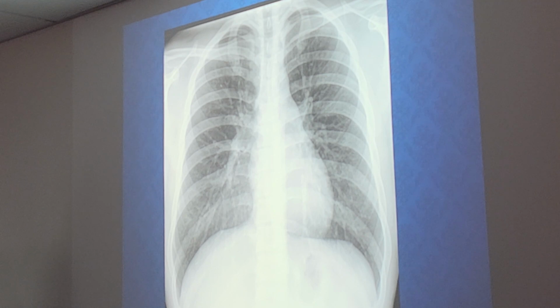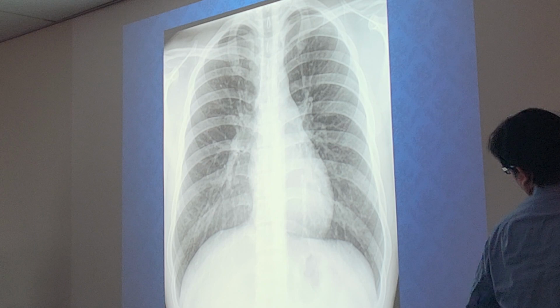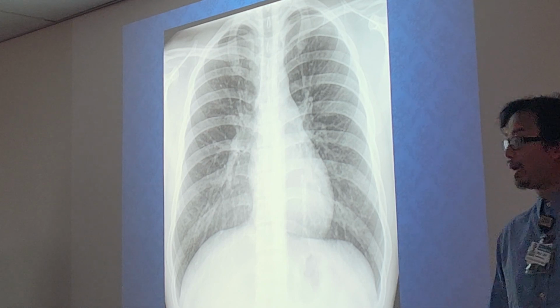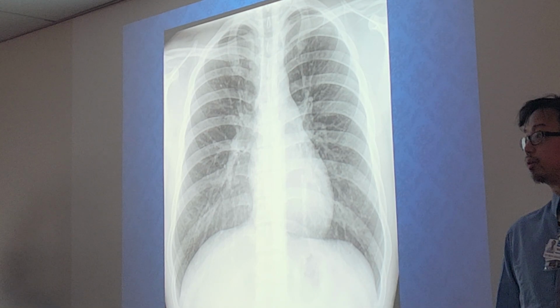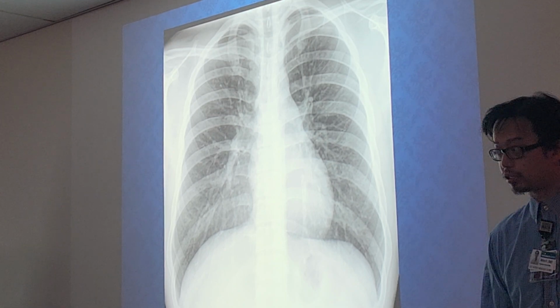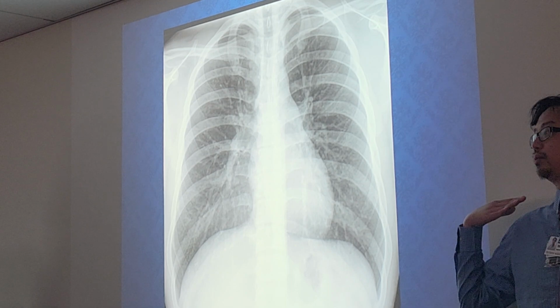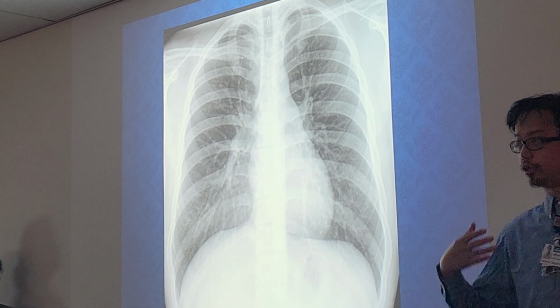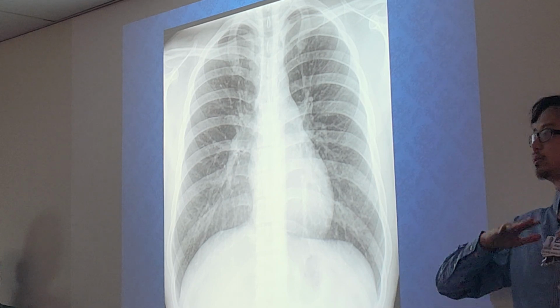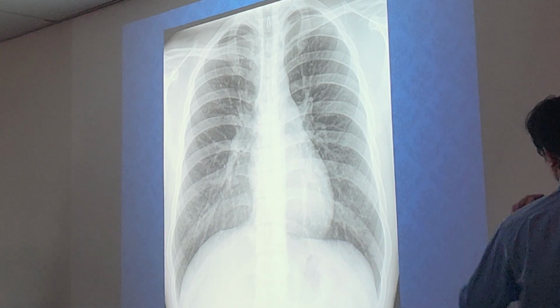If you just think about how the body is positioned, AP versus PA: if you're doing a PA, the chest is flat against the IR and the shoulders are forward. If you're doing an AP, the back is flat against the IR, so it kind of lifts everything up. It's almost like a slight lordotic, because if I'm standing straight like this and I put my back flat against the IR, I'm slightly leaning back. That's why the AP looks slightly lordotic, because everything's being slightly shifted upwards, compared to the PA, where you're putting the front of the chest flat.